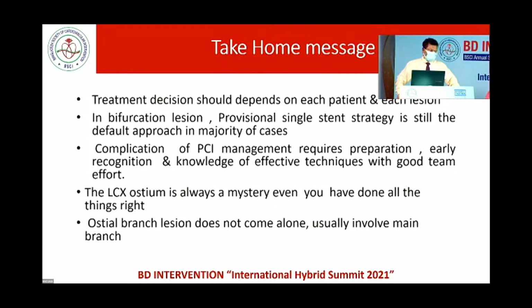ISR, I congratulate Mir Jamal bhai because you came out nicely. At that point, I'm not thinking about ISR. I'm thinking about TIMI 3 flow and the patient being chest pain free, getting the patient off the table, giving adequate antiplatelets, then doing a follow-up angiogram and thinking about ISR at that time. In the meantime, we buy time for endothelialization. Cardiac MR is not going to be a good thing for this patient.